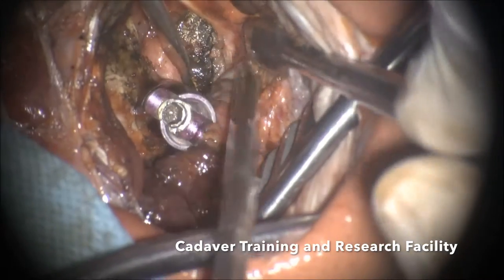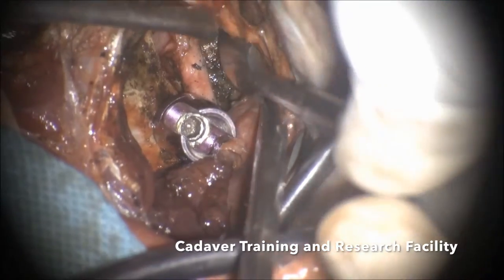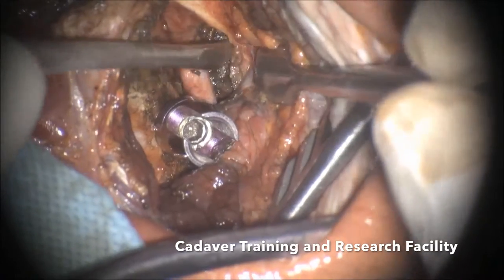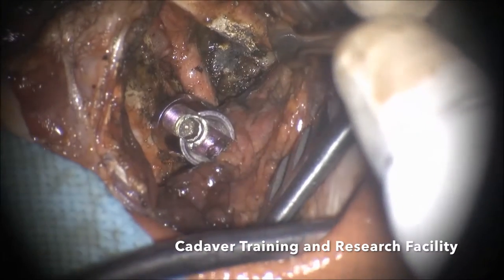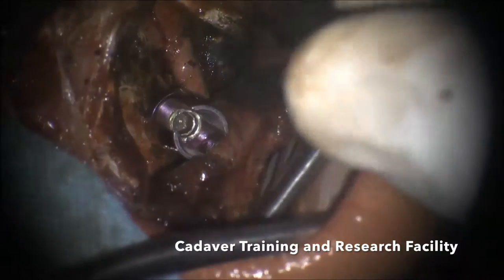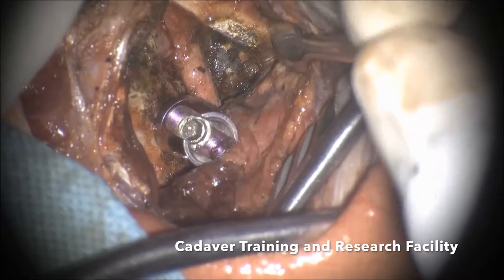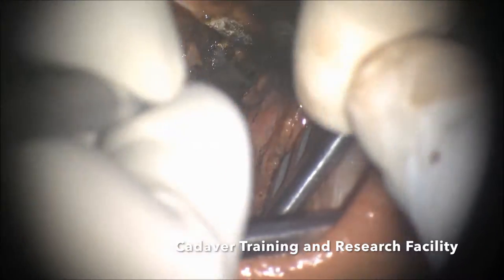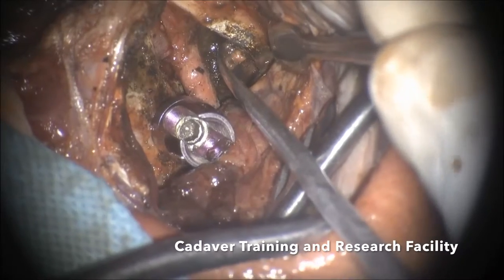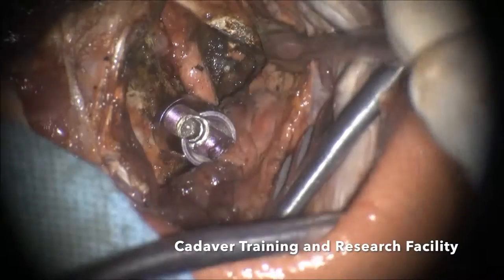Now I have exposed the lateral mass of C1. This is the arch of C1 over here; this is the junction of the lateral mass and the arch — the vertebral artery is above the C1 arch. Some people say you can put a screw through the arch, but that is slightly dangerous and can be tricky as it risks the vertebral artery. The safest point to put the screw is at the junction of the lateral mass and C1 arch — it forms a natural barrier and holds the construct.